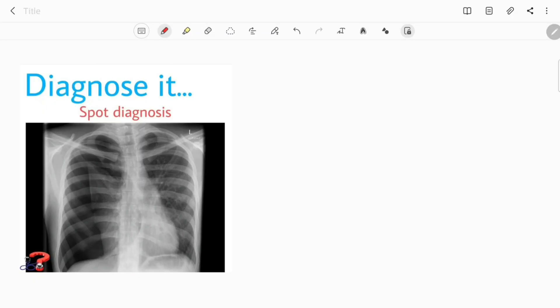Hello everyone, welcome to Diagnose It. Today we have this spot case and we are to make the diagnosis with this chest X-ray that is given. Let's discuss it in the regular way.